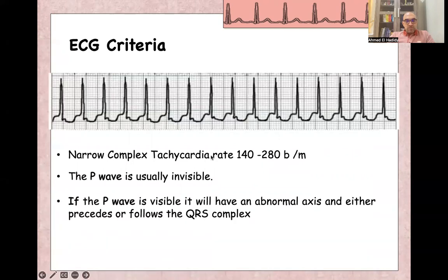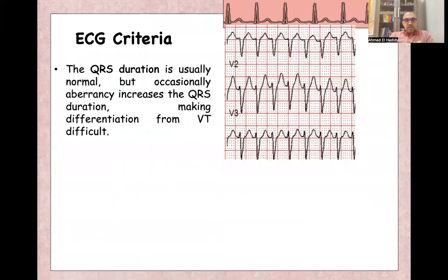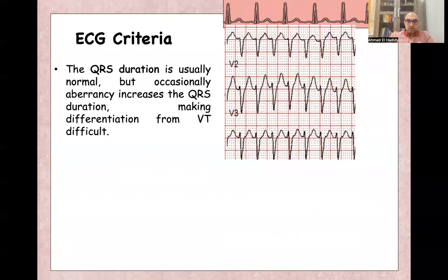Sometimes the P-wave is visible and it will have an abnormal axis, or it can even follow the QRS, like these P-waves. Other ECG criteria: usually it is narrow complex, with QRS duration less than 120 milliseconds. Sometimes aberrancy can lead to wide complex and make differentiation from ventricular tachycardia more difficult.